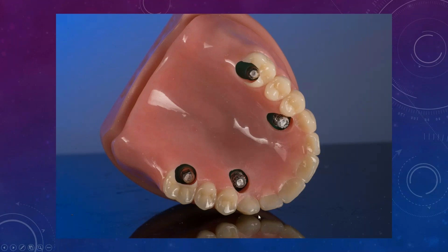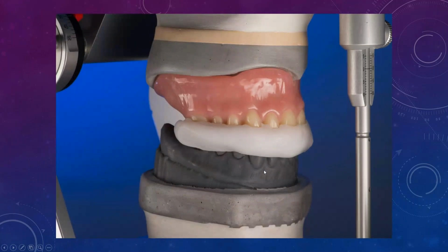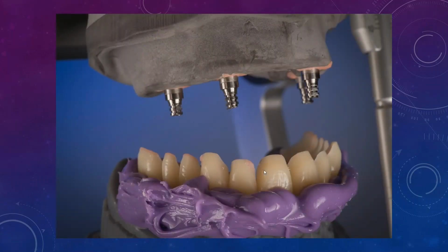So as long as you have that occlusal part there, that's all you really need, and make sure it's attached by two implants. Okay. Same thing, bite. So when you get to the lab, you can transfer everything, and you can actually have the setup transferred as well, because you know which teeth you used for the denture, and you can just have another order of teeth ready. You can just put it into the bite registration.